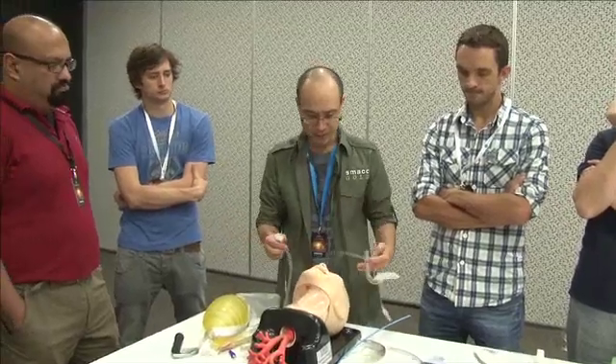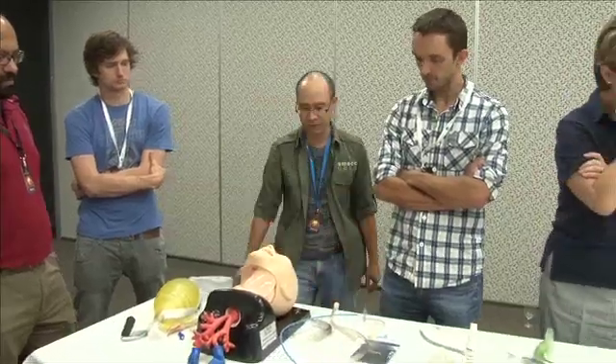All right, so you guys can have a practice with the fast track.